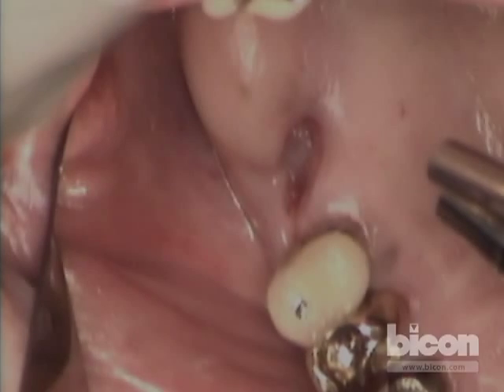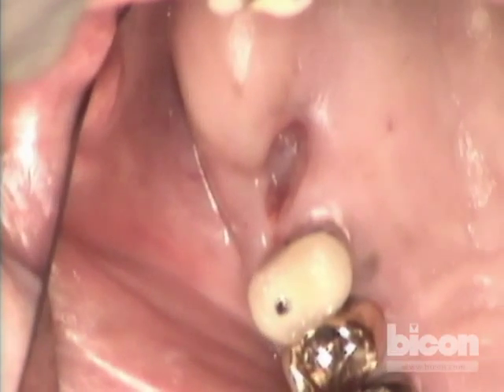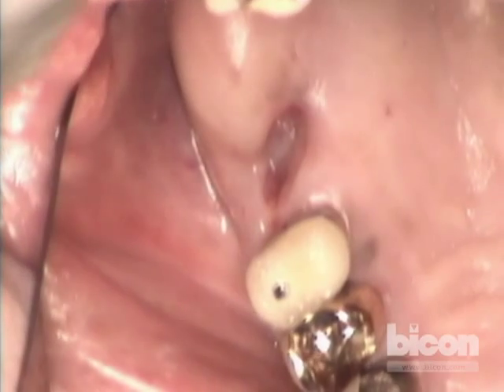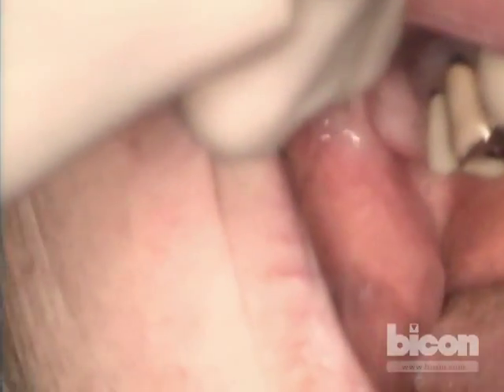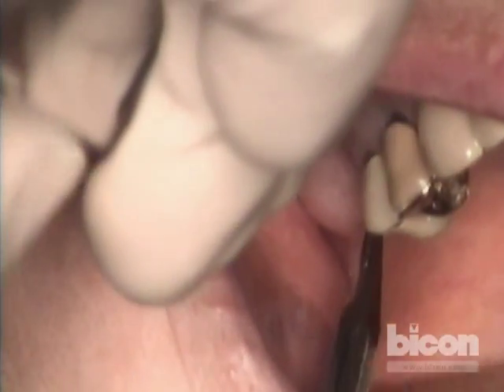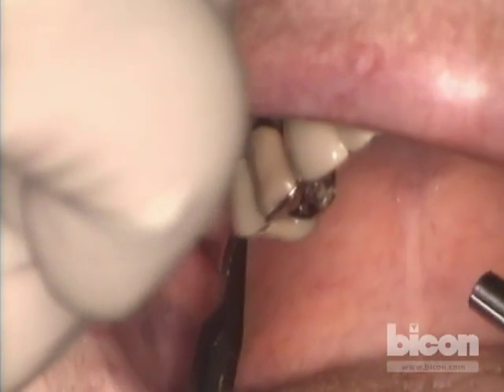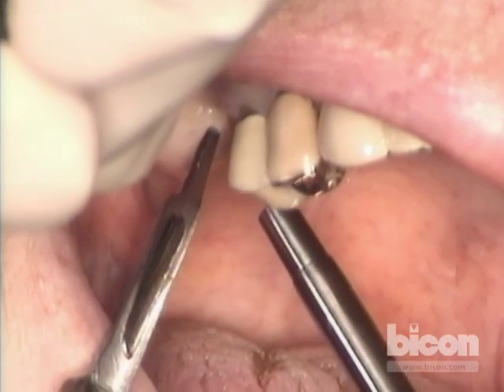You can easily see the kind of defect we are dealing with. We have basically no grafting in the area; the sinus, as you recall from the radiograph, is not near the area. We'll make an incision that will allow us to close over should we decide a one-stage procedure is not optimal. However, because of the lack of complete epithelialization and because the socket and bone appear adequate, what I'm going to do is essentially a core — akin to a punch flap.